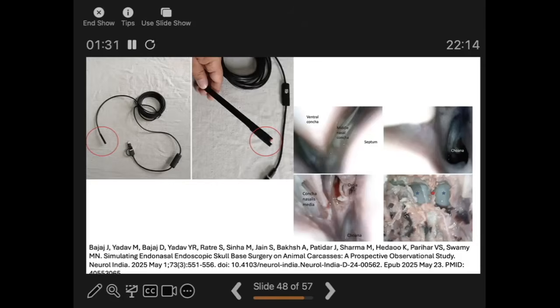By breaking the posterior 1/4 of the nasal septum, bimanual work was possible, similar to human beings. Further removal of the anterior sphenoid wall exposed the sphenoid sinus and central sphenoid septum, closely resembling human anatomy. This model provides a valuable training alternative when cadavers are not available.